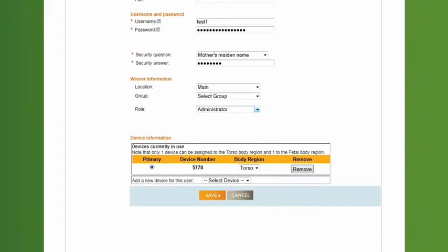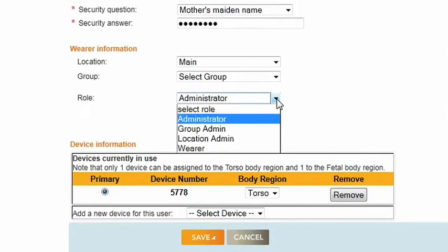When creating or editing user profiles within your account, the role you assign can limit access to certain functions on the site. The Administrator role provides full access to all functions on the site, from placing orders and performing readings for devices, running reports, creating or deactivating locations and users, to registering and initializing devices.